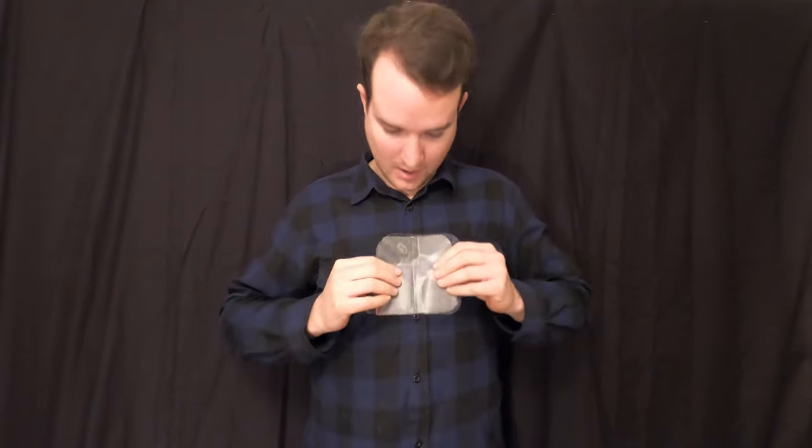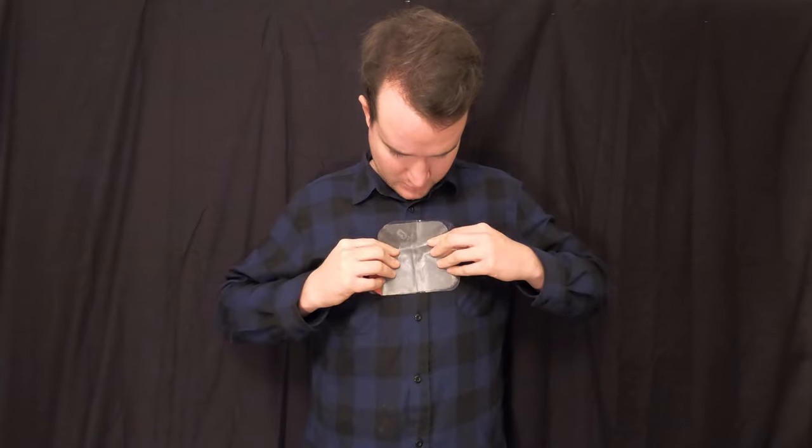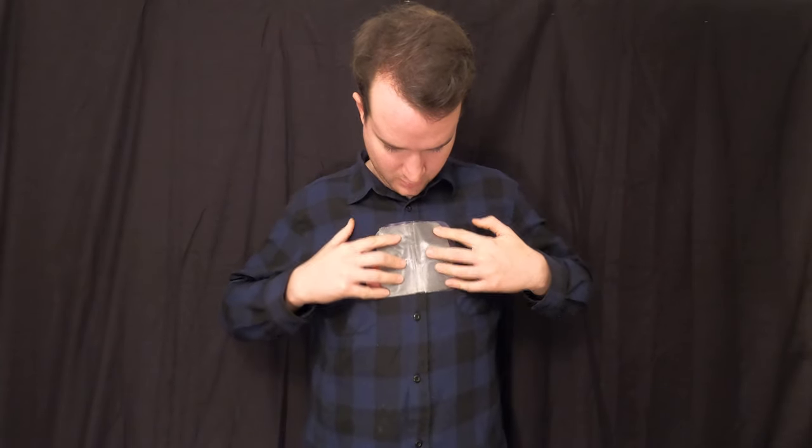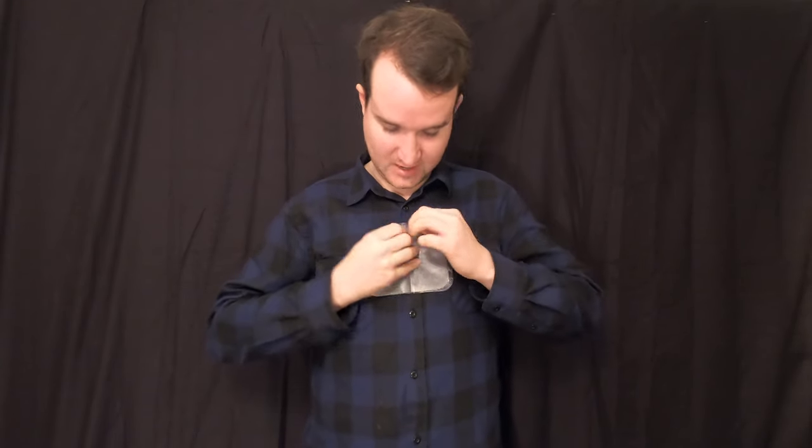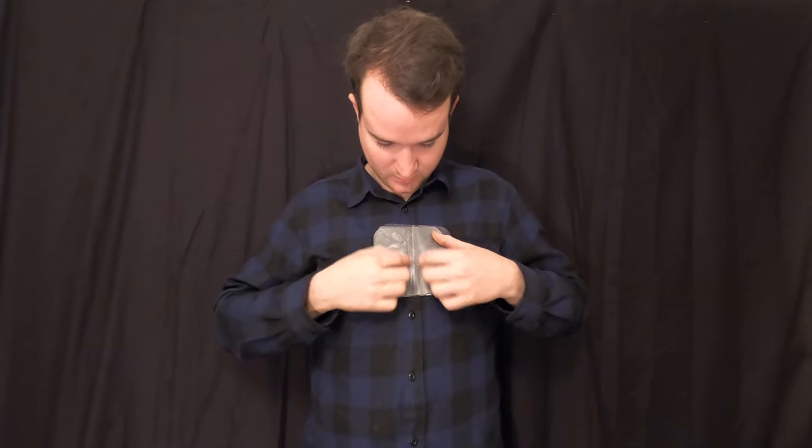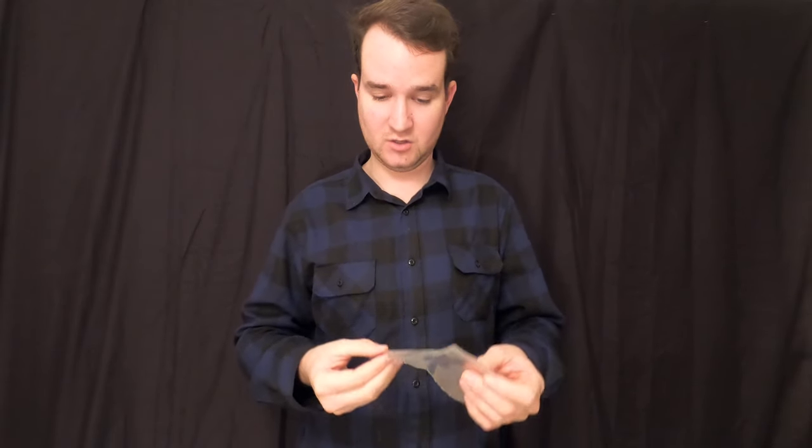So say my button right here is the wound, I'm centering it right there on the wound, placing it down and I'd seal it and everything and it'd be there. The vents would then help with any escape of air, a person breathing out but nothing's actually getting in. So that would be how I would have the chest seal set up.